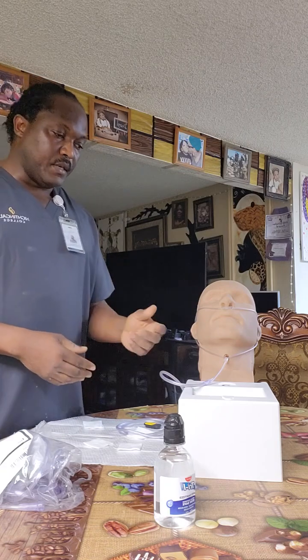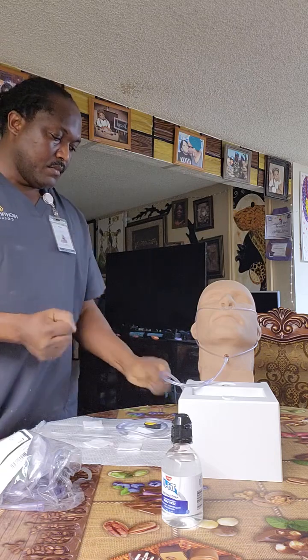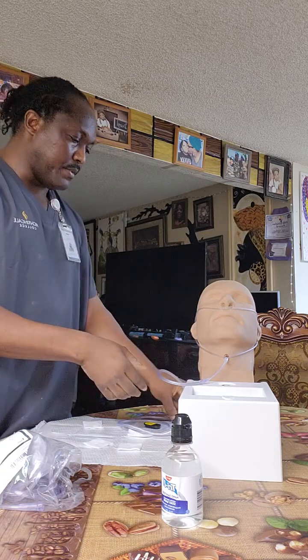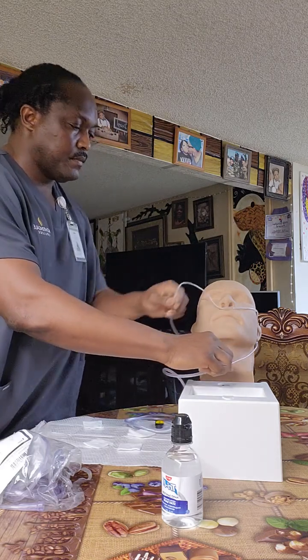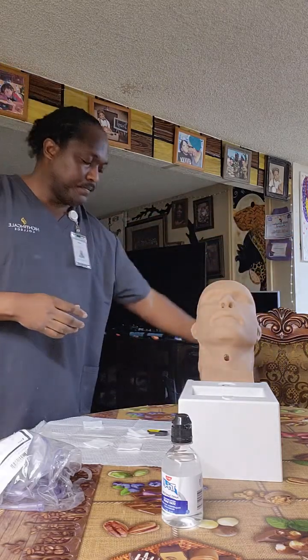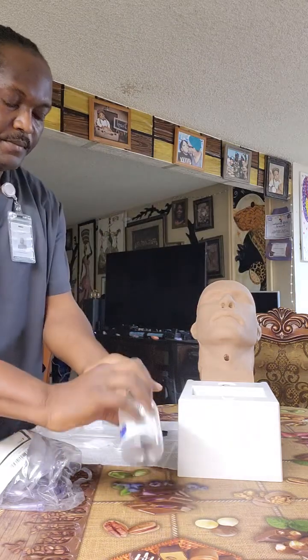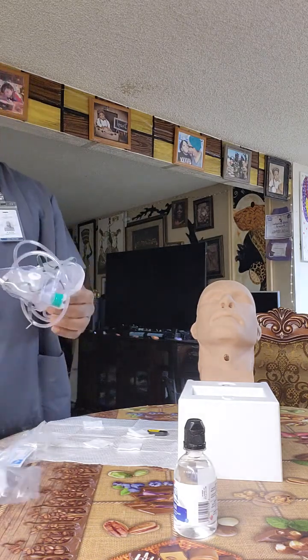I think the doctor wants us to step up the oxygen flow rate, so I'll go ahead and perform hand hygiene. Then I'll unstrap it. Then I'll discard it. Again, perform hand hygiene. And I'll take the non-rebreather mask.